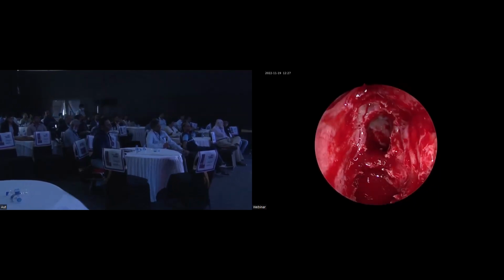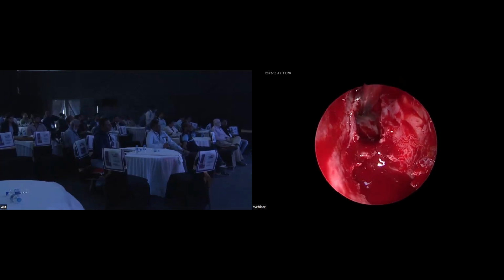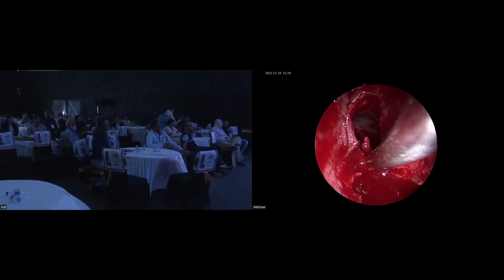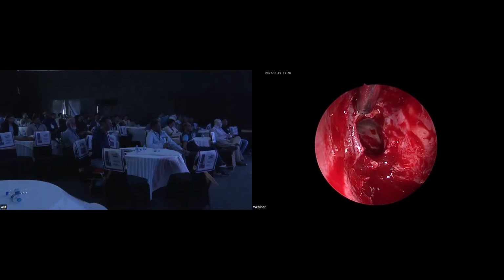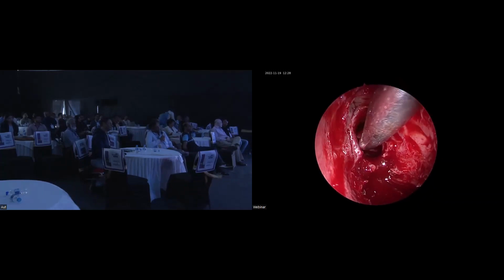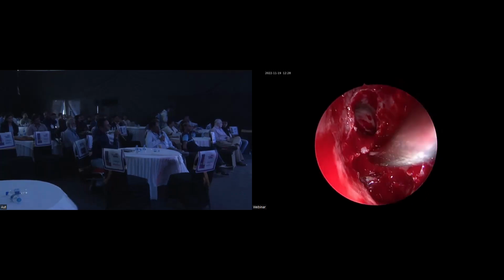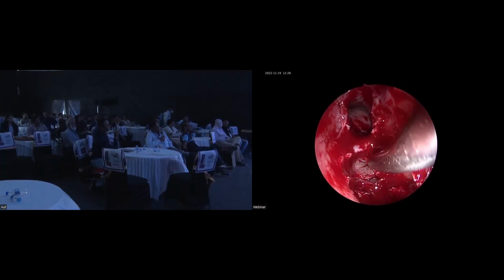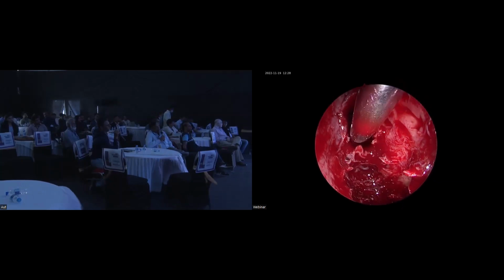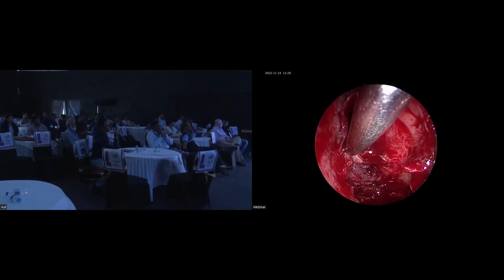Are you seeing it? And as I had discussed while discussing the scan, that's a Keros type 2. So one has to be very careful when you are dealing here. Because you have a very deep olfactory fossa. And this will be somewhere the area of the anterior ethmoidal artery. As per the scan, it is almost not surrounded by the bone everywhere.